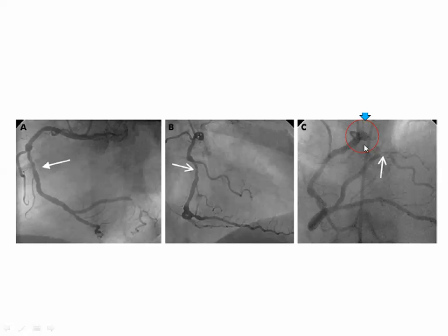Anterior posterior, in the middle. Okay, so this AP, okay, or PA. The AP you expect it to be resembling the RAO or LAO. What's the position of your heart normally? Yes, it's RAO. Okay.